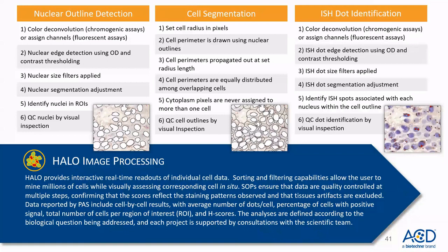The benefit of using Halo software for us is that we can easily analyze those whole tissue scans, but we also have other capabilities such as automated tissue classification using an AI-based machine learning program, which, for example, can allow us to differentiate between the texture of an image so we can separate out tumor versus stroma using the software, rather than hand annotations. We also can perform more complicated analyses such as for ISH, IHC analyses.